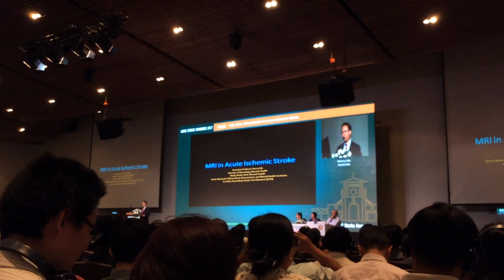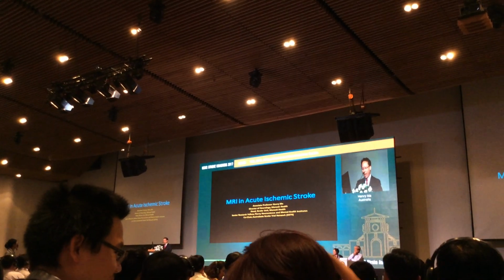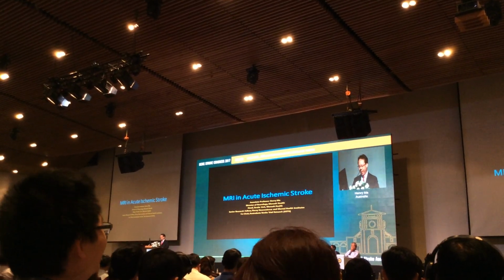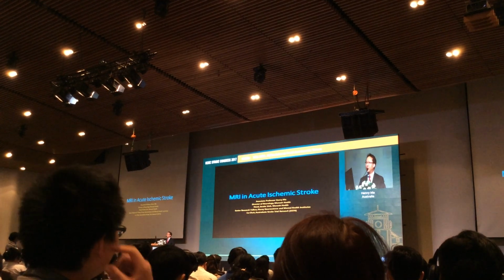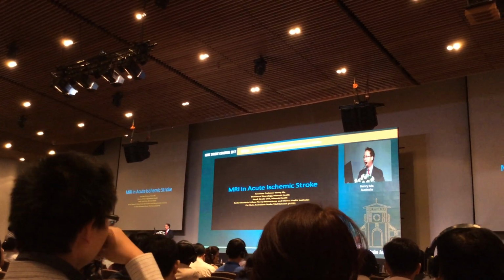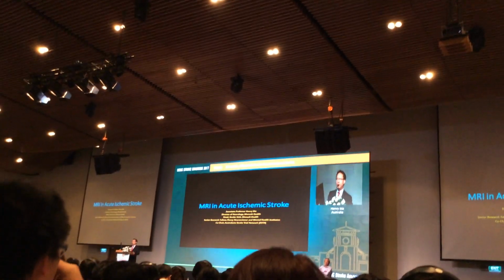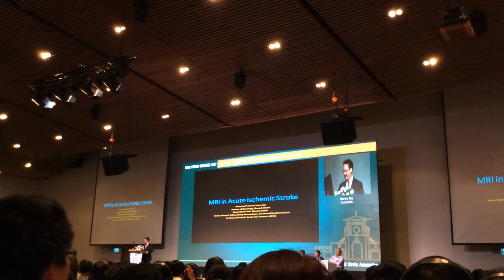Because it's not widely available and a lot of people don't use it, what I'm going to do is go through it as a more practical session, going through cases of how MRI can be used in an acute stroke setting. I'll have much less evidence, but much more practical cases.